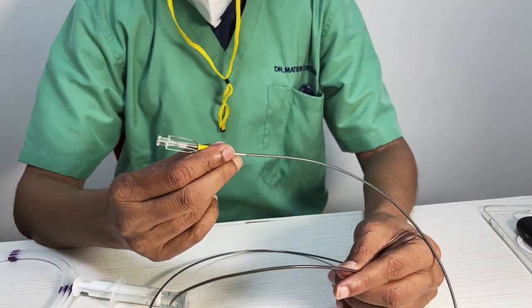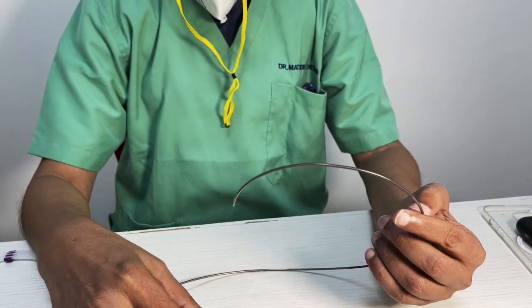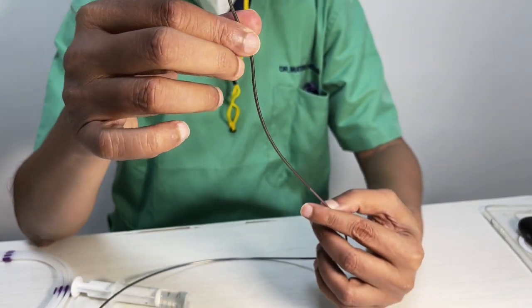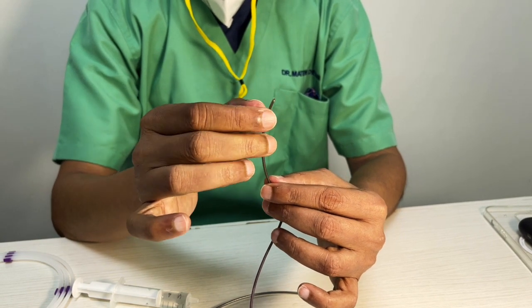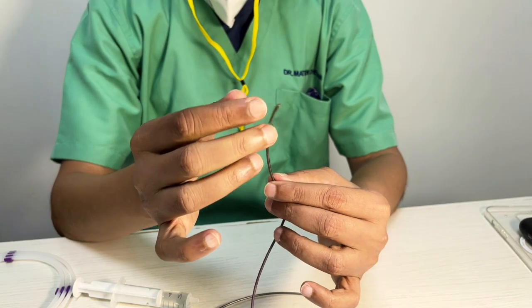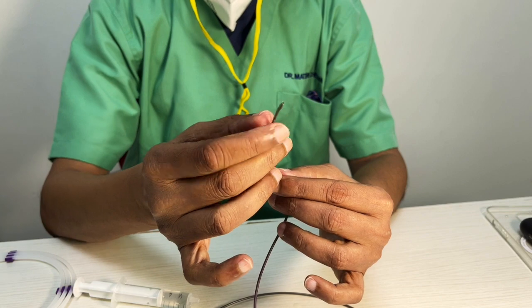ACE was the first suction catheter that came into the market, at least in India, and we were very excited about it. But again, the one thing they have done is they got a fantastic lumen. Okay, so have a look at this. Now, what's happening? This is the problem with Penumbra. Penumbra still clung on to stainless steel purely because of the pushability. But you see the problem.